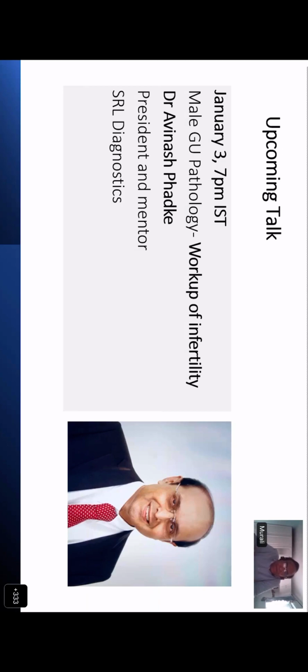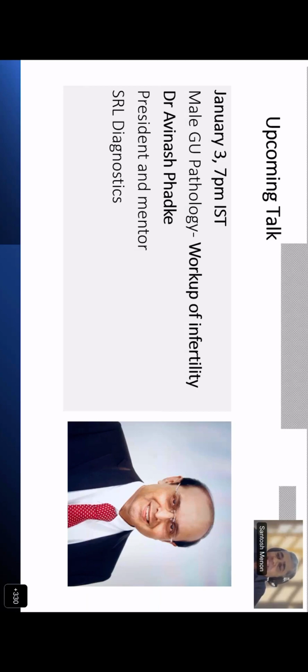Fantastic tips, sir. Fantastic. I think these are pearls of wisdom from Verma sir, and you should all take home these messages, because these are day-to-day problems which you will come across once you start becoming practicing pathologists. I'm sure there are several practicing pathologists. Are there any questions, Dr. Tala? Yes, sir. There are a few questions.